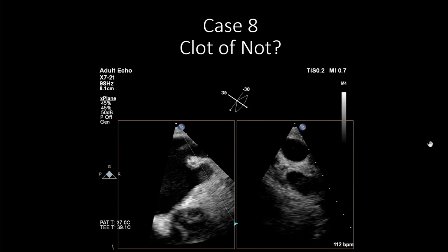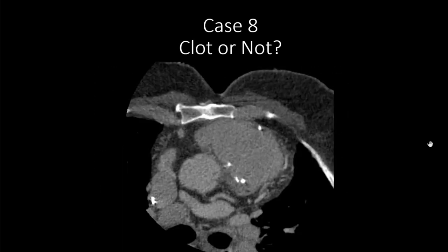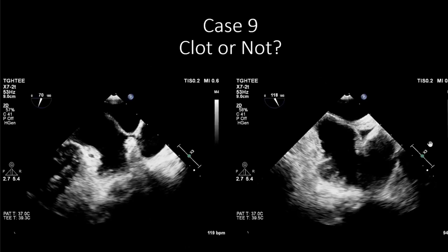In terms of actually getting a 3D volume, I think sometimes 3D helps you visualize the stuff around it — if it's a clear ball. But I'm not sure how much it adds if you're already uncertain, especially for the left atrial appendage. For figuring out clot, biplane is probably the most useful mode. And here, looking at the anatomy, you can see lots of pectinate at the tip of the appendage. If you cut through, that gives you reassurance that you're actually clean and confirms what your anatomy is and what you're looking at.